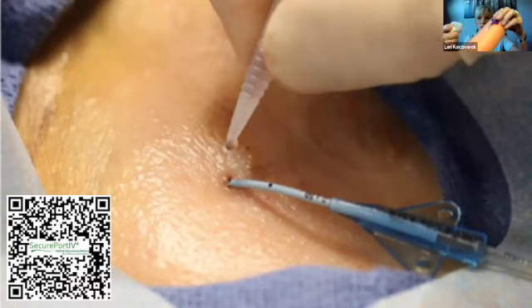Or like I was just talking about the dot and dab, you can wick some of it away. So if you've got too much on there, and we do that a lot more in the NICU population where you don't want to leave too much on, you can just wick it away. The glue stays liquid for a good minute or two. So you have an opportunity to sort of recover some of the glue if you put too much on. So it's just whatever your technique is going to use. If you're putting too much on, yes, you're going to get buildup on that catheter. The remedy is generally just don't put so much on, and it will continue to slough off as your dressing changes progress, as that catheter stays in.